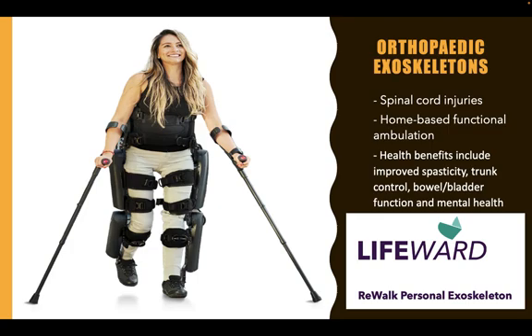There's a huge drive to incorporate robotic and computer-assisted orthopedic surgery that we call CAOS. And there's also a use of AI in arthroplasty and robotics where there is differing evidence regarding a lower revision rate, lower risk of manipulation under anesthesia, decreased systemic complications, lower opioid use due to lower postoperative pain, and faster return to range of movement and baseline function in those active.